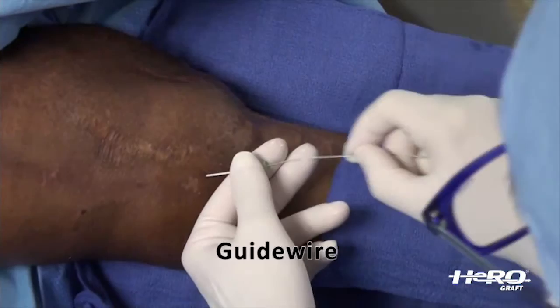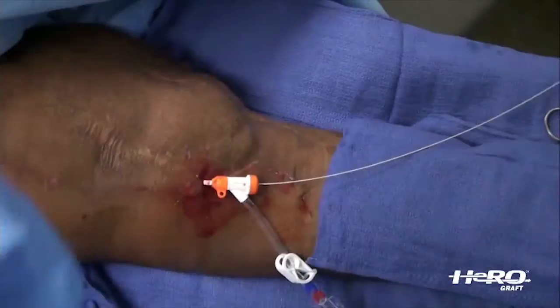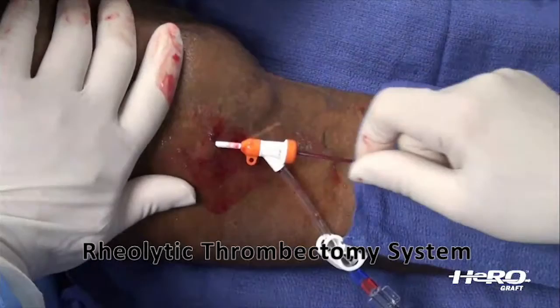HeRO has no venous anastomosis because the tip of the outflow component is located in the mid to upper right atrium. Do not extend devices beyond the tip of the venous outflow component to avoid dislodging HeRO. Do not pull a fully inflated balloon through the titanium connector to avoid balloon puncture.